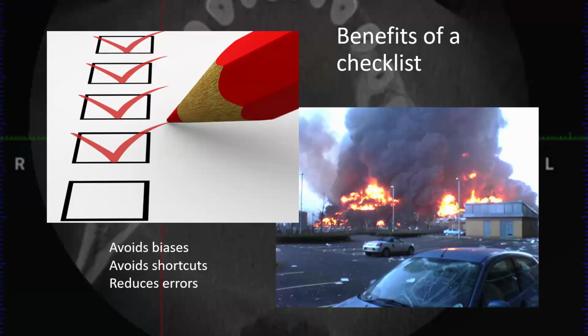You can also see it in the skull as well. You can see intracranial carotid artery calcification, but the common one is the cervical carotid artery calcification. And so, yeah, I have in my mind a certain amount of anatomy I'm looking at in each of these categories and things that I'm going to comment on if I see them.